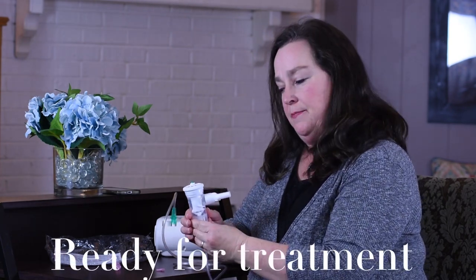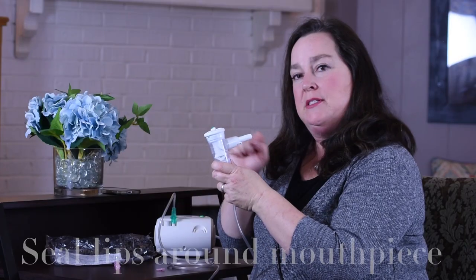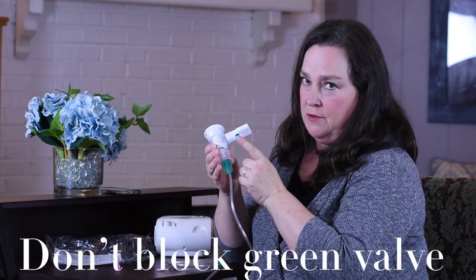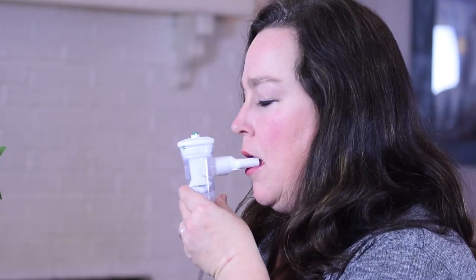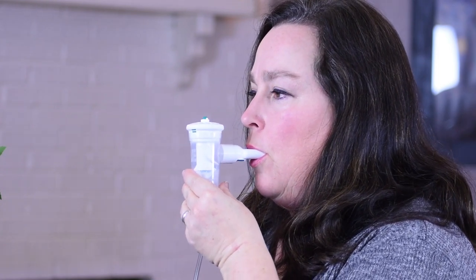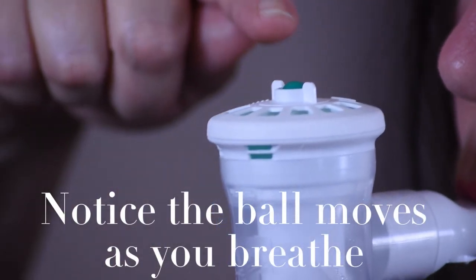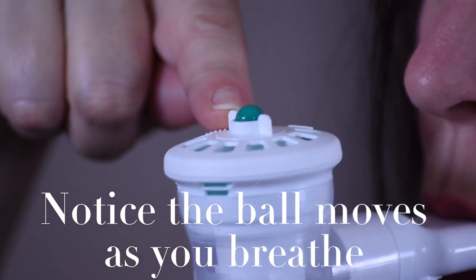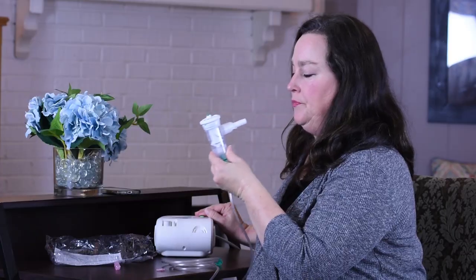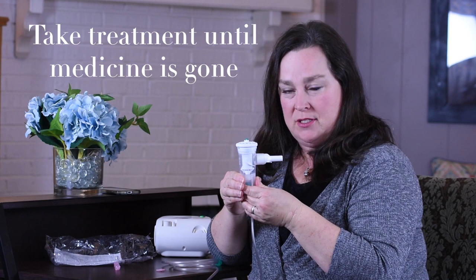Now you're ready to take your treatment. Turn your nebulizer on and place your lips tightly around the mouthpiece, making sure not to block the exhalation valve. Continue taking your breathing treatment until all the medication is gone.